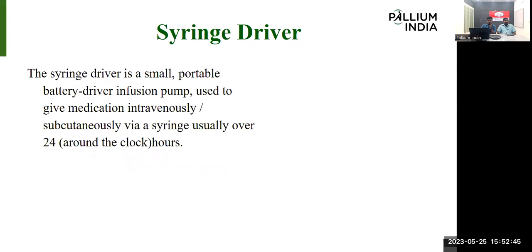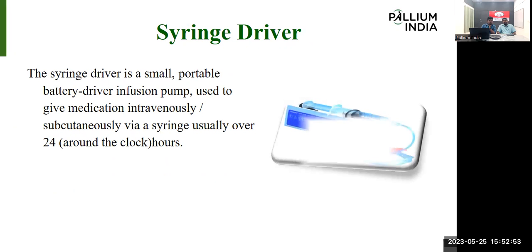This is about the syringe driver that I already told you about. This is a picture of the syringe driver. As I already told, it's a small portable battery-operated driver, like an infusion pump or syringe pump. A syringe pump is a little bigger and needs a stand for fixing.